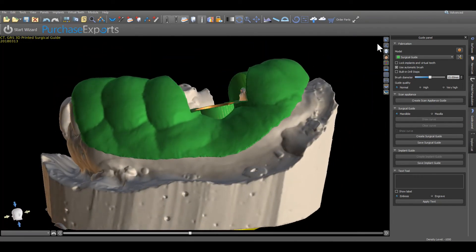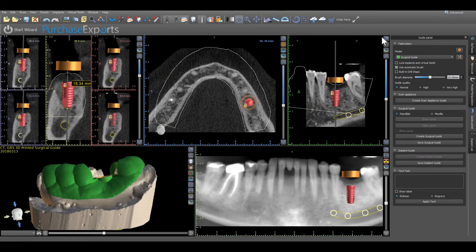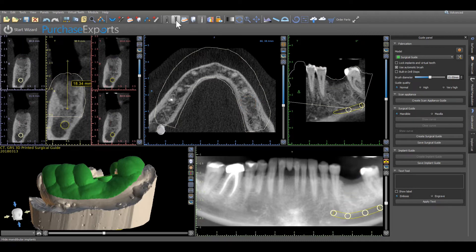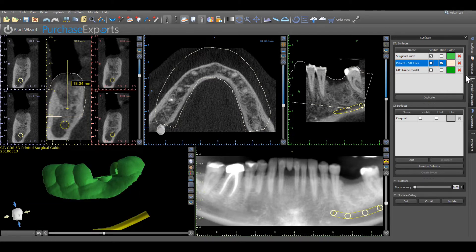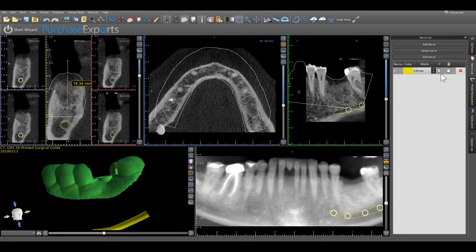It is also suggested to view the surgical guide in its native state by removing the model and guide tube elements from the 3D screen. This is easily accomplished by clicking on the implant icon at the top of the screen to remove the visibility of all implants and guide tubes. Then, highlight the surfaces menu and turn off the visibility of the original model along with any rendered nerves by clicking on the nerve list button and turning off nerve visibility.